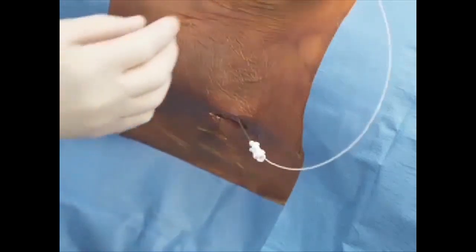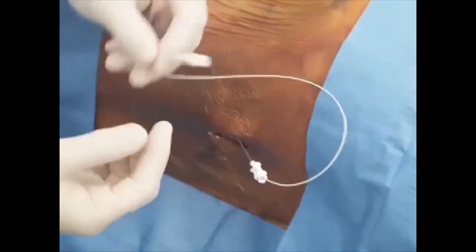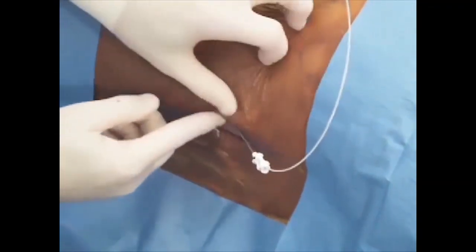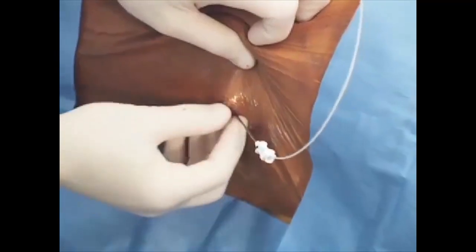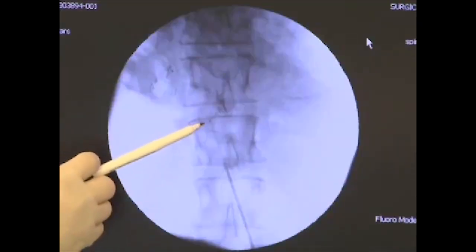Do not pull back on the catheter with the spinal needle in place. Pulling the catheter back could lacerate or shear off the catheter in the intrathecal space. Confirm the position of the catheter tip with fluoroscopy.